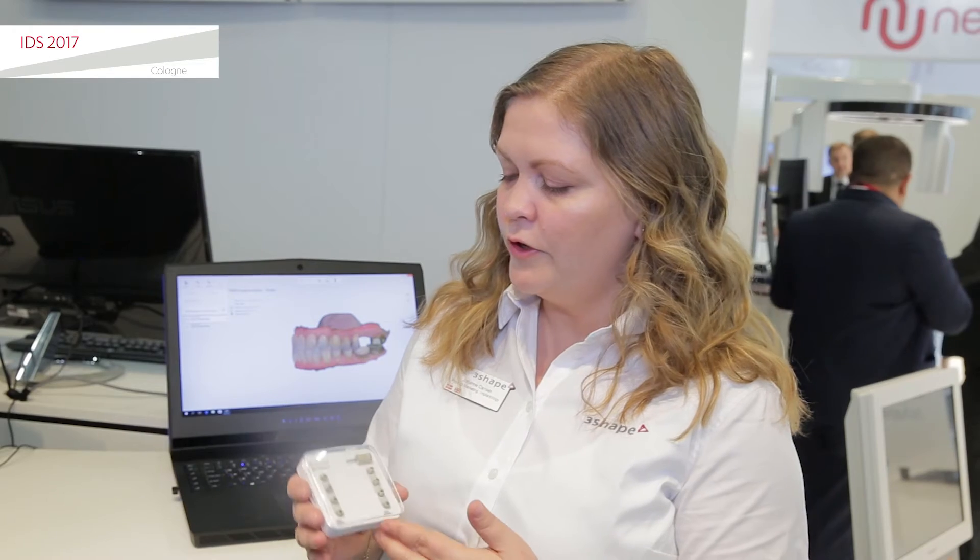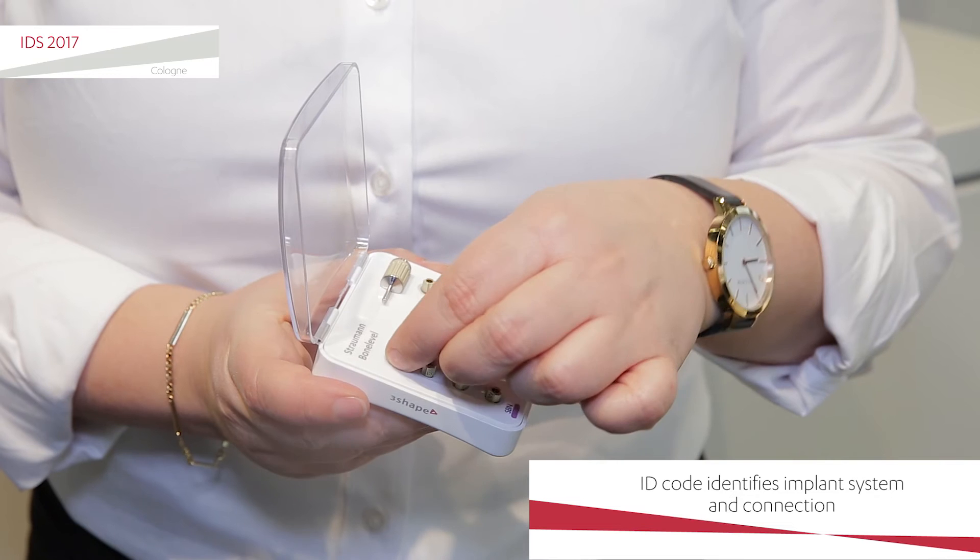You get all your scan bodies from one provider. They're available for all the major implant systems. And they're also made of titanium, so they're highly durable. They can be reused up to 100 times, autoclaveable of course. And also, we've put in this cool new feature, which is an ID code.